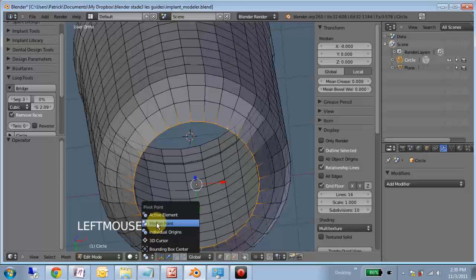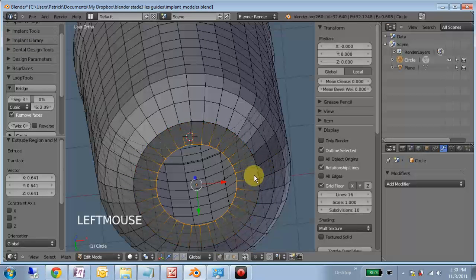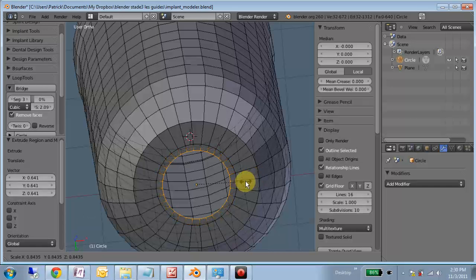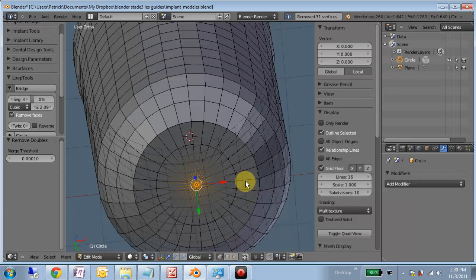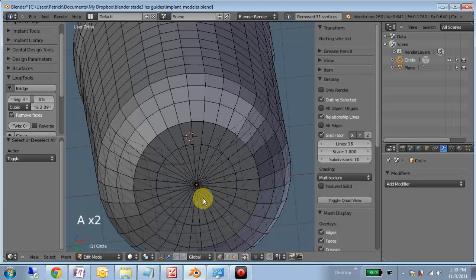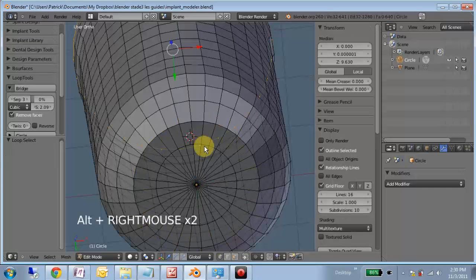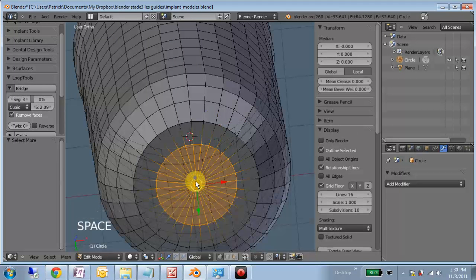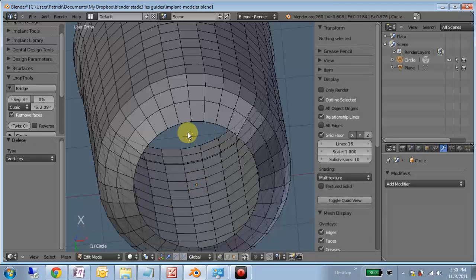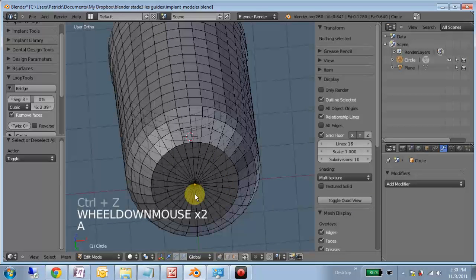Make sure this is select on median. Extrude, scale, come in a little ways. Extrude, scale again, and hit 0. Now remove doubles, and that will merge all those points here. Now if we ever want to get back to this ring, we can either simply loop select it. Notice this loop will select as well, or we can select this one point and then delete these, and that will give us back to where we started. We'll use this trick again later.